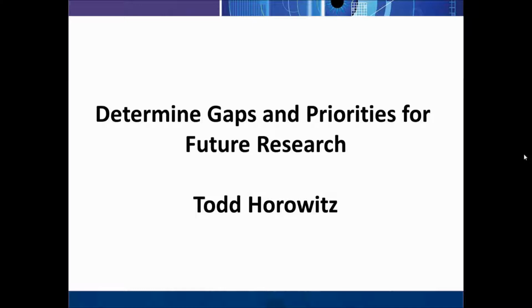In fact, the ABR has 800 workstations in Chicago. I go there fairly often, and they're all calibrated. They're all DICOM calibrated. They're pretty much good uniformity across them and stuff like that. So they're good experimental conditions. The lighting is variable, sound deadening, all those sort of things you'd like to have for that sort of environment. Well, it would be great if that could be in some fashion institutionalized.